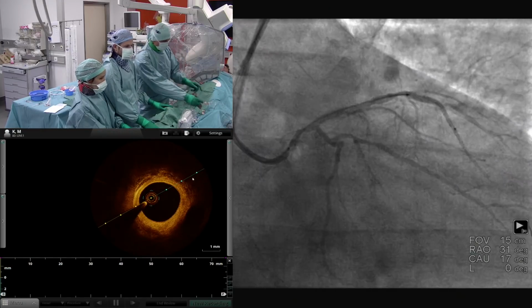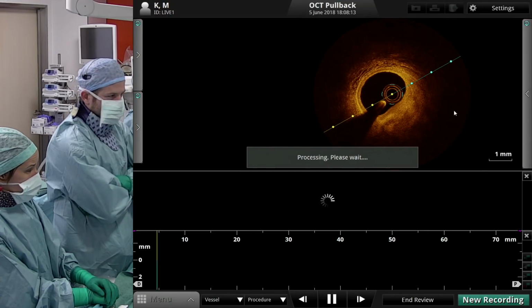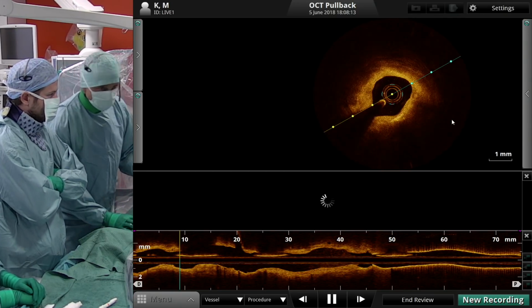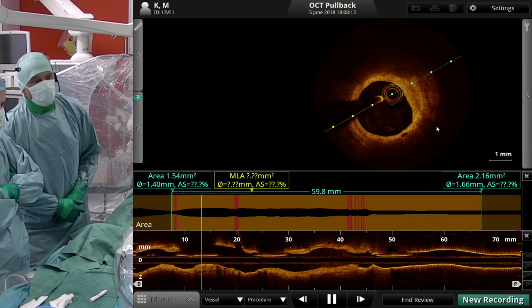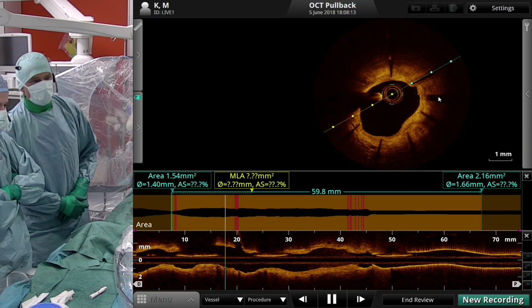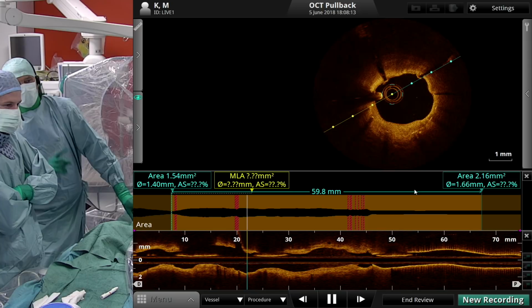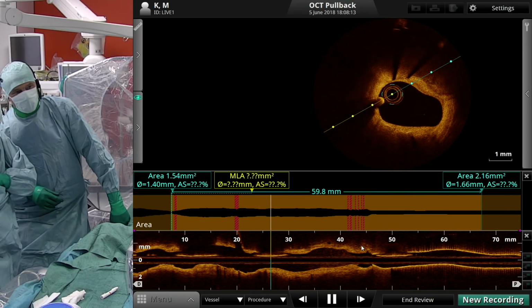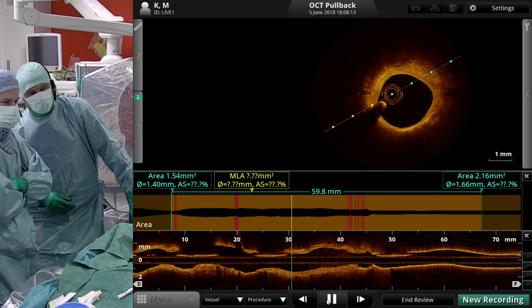Not sure it will be perfect, but again, it is a left main, and this is something we know is a little bit more difficult. And the pressure is back. Yeah, pull it back. I don't know whether we see something. Yeah, I think it was... It's actually quite not good. Too bad, Bernard, despite the fact that the guiding was not selectively engaged, or at least you did the best you could. No, it was selective, because on this side I can't see, but the quality of the clearance, I would say, is not too bad actually. I let it go till the end.